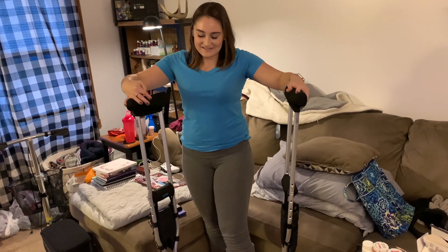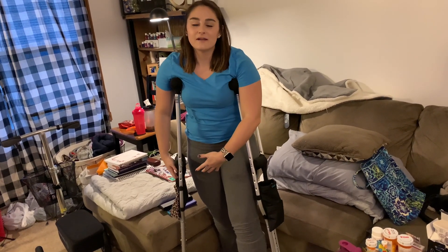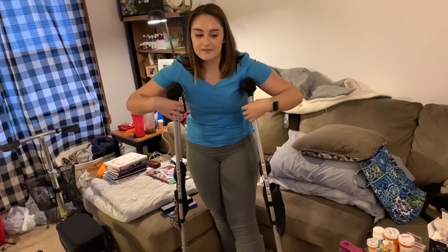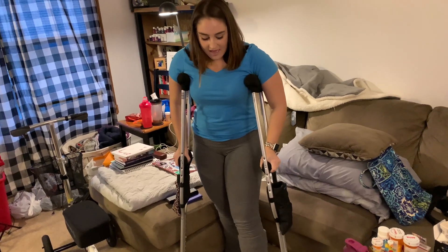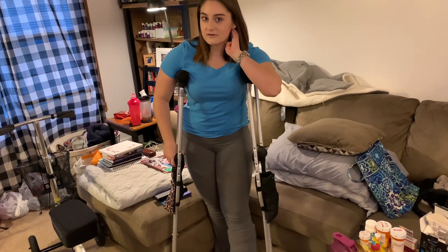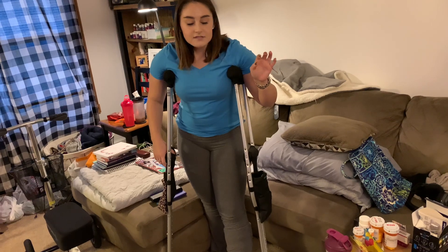All my weight goes to my right leg. Put both crutches under my armpits — when they're stable they need to be evenly distributed, not lopsided. It's also really important to have your crutches at the right height because if they're too tall or too short they're going to be really uncomfortable and you're not going to be as stable when walking.